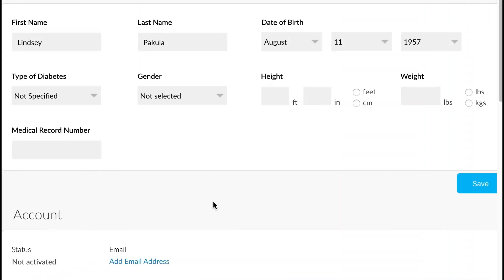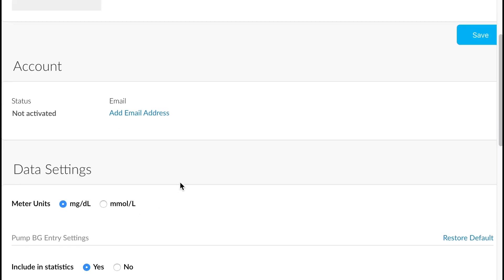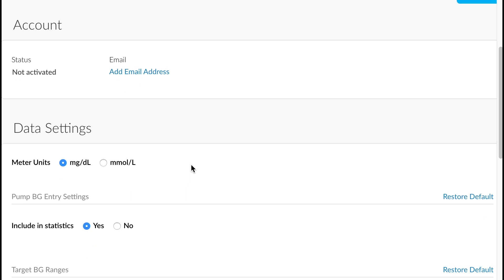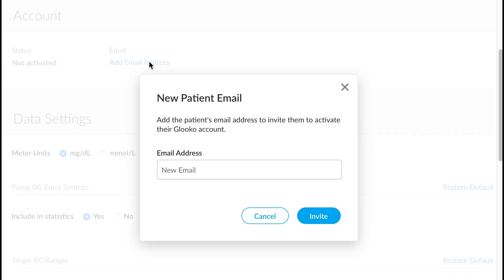If we scroll down here to the account section, you'll see we have the option to add an email address. Once we add an email address, it actually gives us the ability to send an invite to the patient. So if we were to add an email here, valid email, then an invite would be sent to the patient.